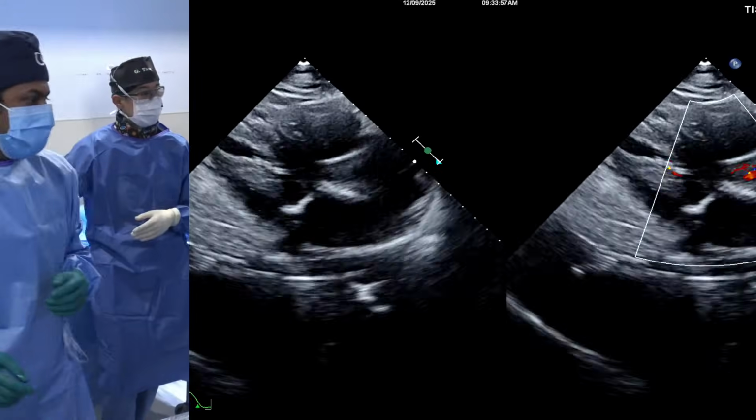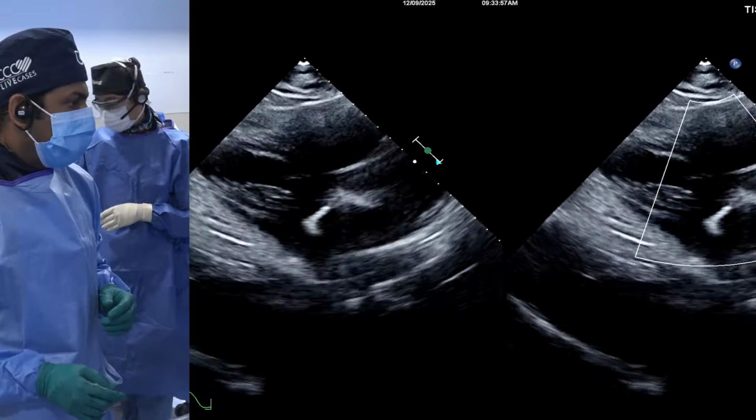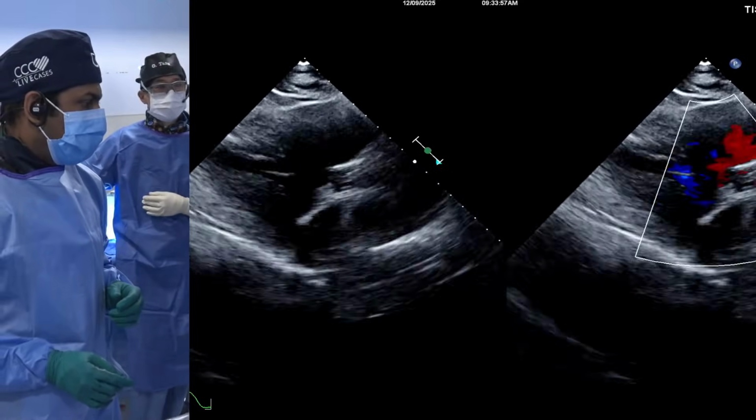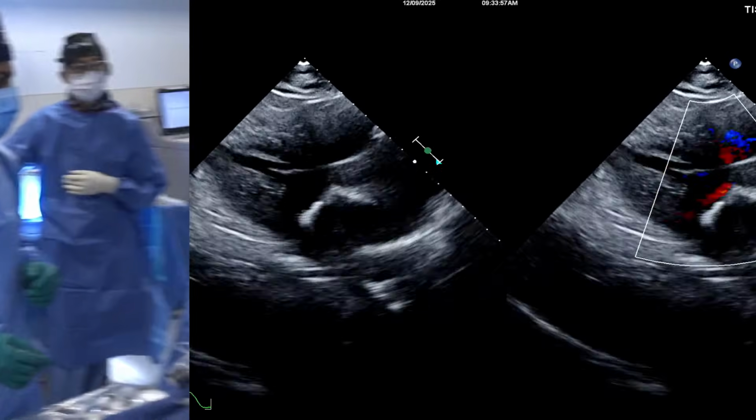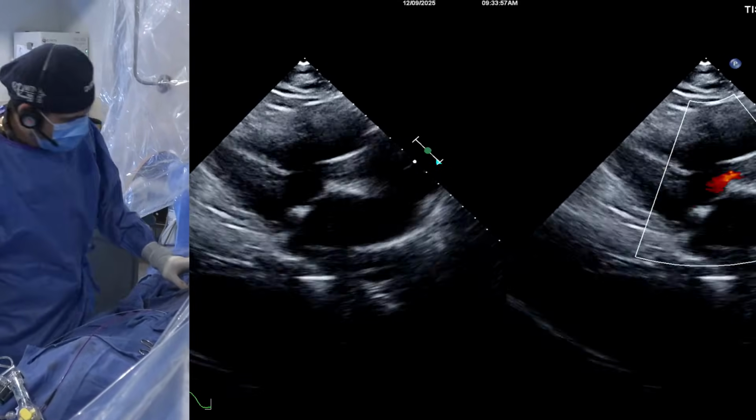One more thing about AR, if I can finish, is the sizing, right? They're out of size. The reason I said Myval is it comes in a bigger size than your conventional balloon expandable platforms. That's being used for AR cases in India, the bigger Myval.